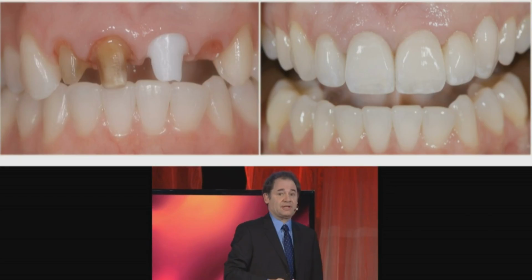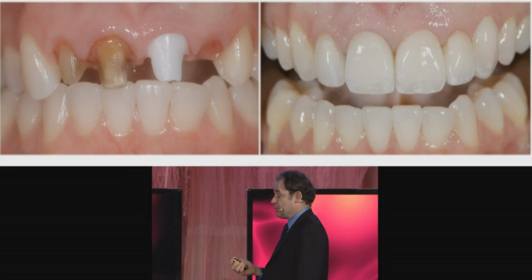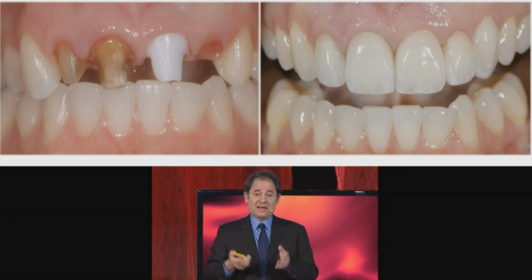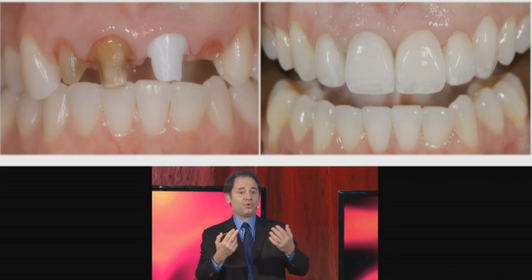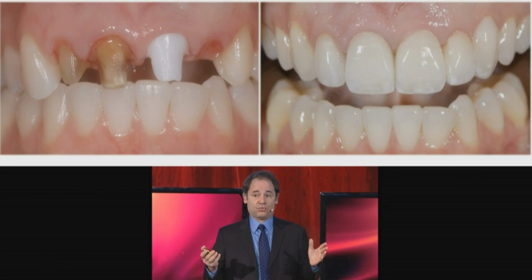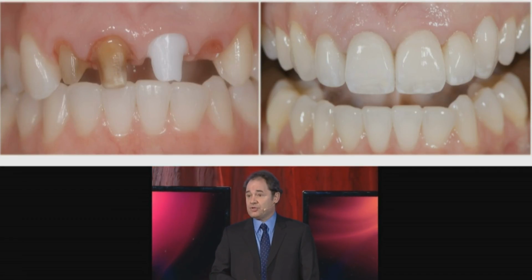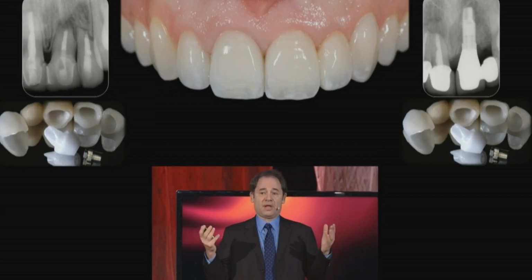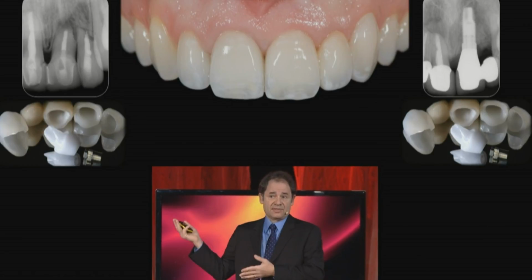Now, there is another situation that happened here: you have extremes in abutment colors. When you have a checkerboard effect, be very careful if you use a ceramic material that is too translucent, because you're going to have uneven reaction to light. So what we like to do is to equalize the reaction to light with zirconia material. And that's why you have seen such a resurgence of zirconia applications in the last 3-4 years, because the zirconia will equalize the reaction to light, and then your ceramist will layer the aesthetic porcelain on top of it. It's exactly the same system.